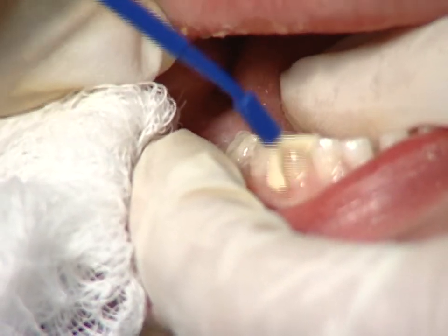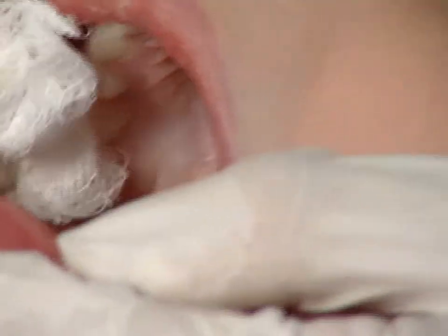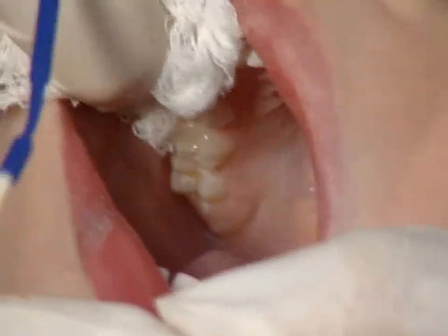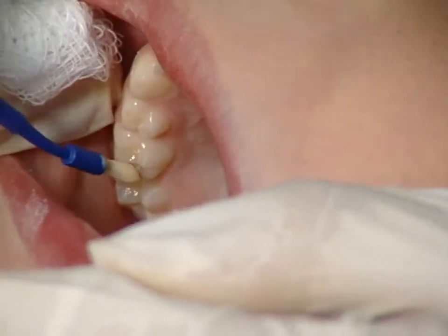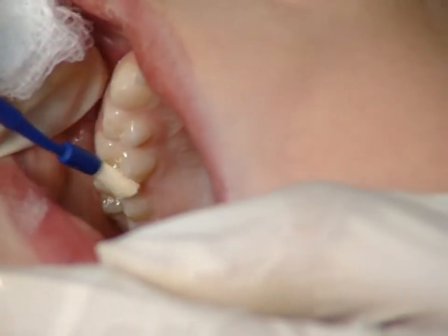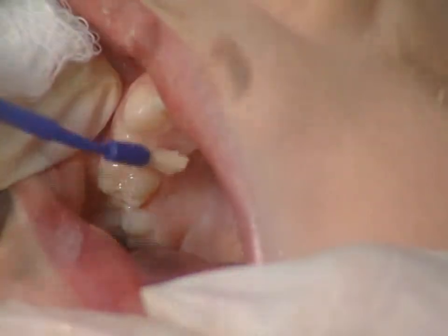Frequently, we do not do the lower incisors as they rarely get cavities. As you paint on the varnish, make sure you cover all the tooth surfaces. Once the varnish is on, you do not have to worry if it gets wet as it sets on contact with saliva.